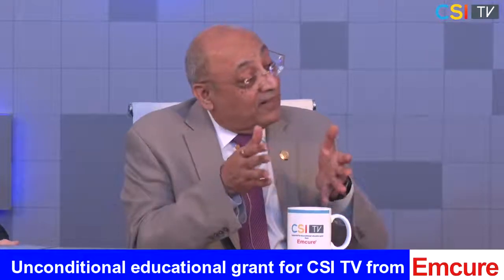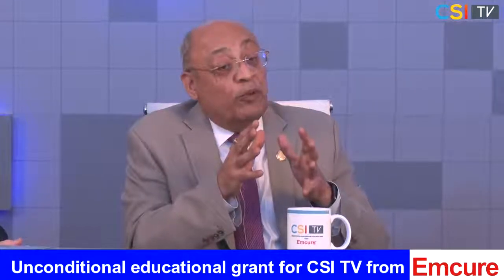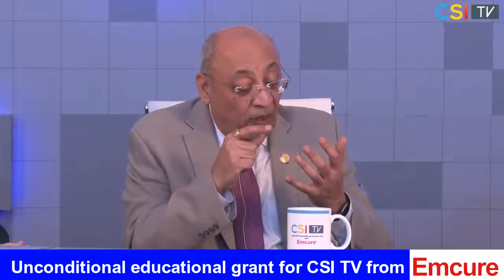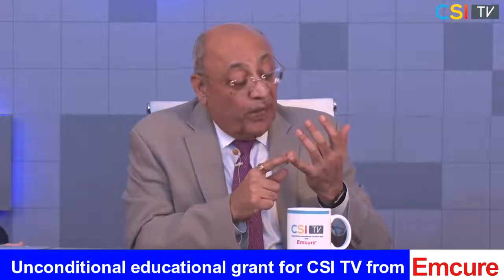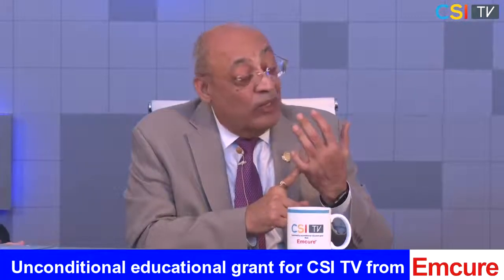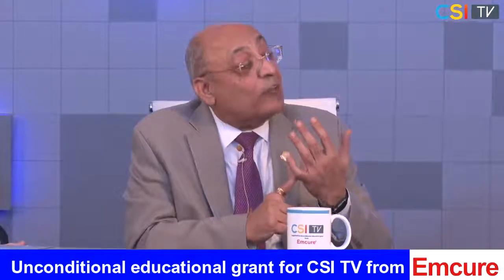So, as it stands, CT-FFR, or CT angiography, should be able to give us a triply effective phenomenon, including all the stenosis, the plaque characterization which is likely to contribute to it, and finally the FFR also, making it probably a preferable diagnostic modality which we should explore further.